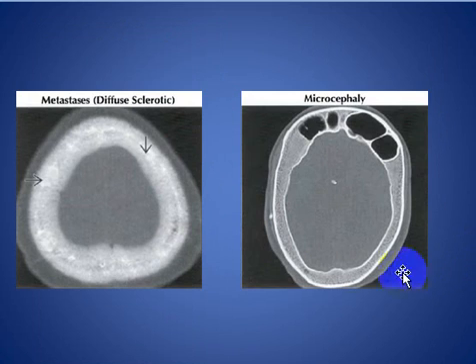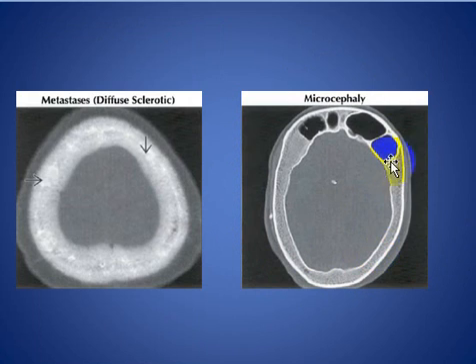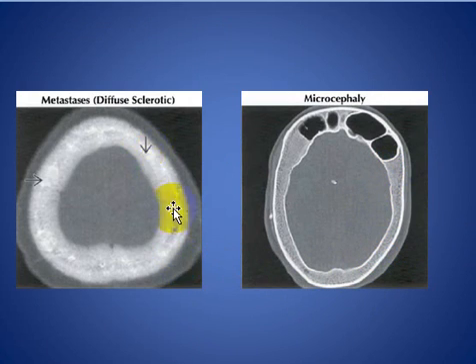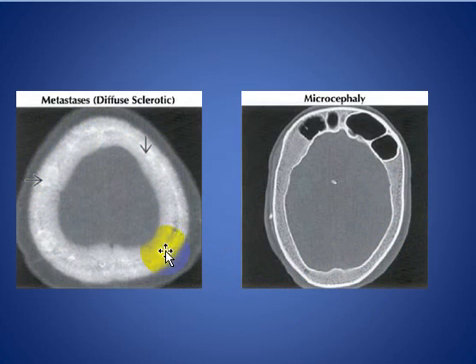Another cause is microcephaly. This patient has microcephaly with diffuse skull vault thickening. Here is another patient with diffuse sclerotic metastasis causing diffuse skull vault thickening.